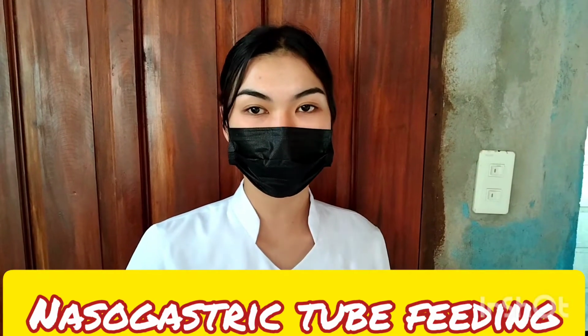For today's video, I am going to show you the procedures about nasogastric tube feeding. But what is the definition? It is the installation of specially prepared nutrients into the stomach through a nasogastric tube.